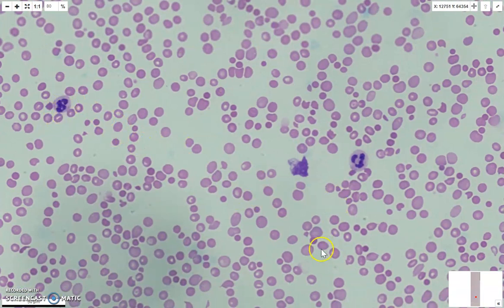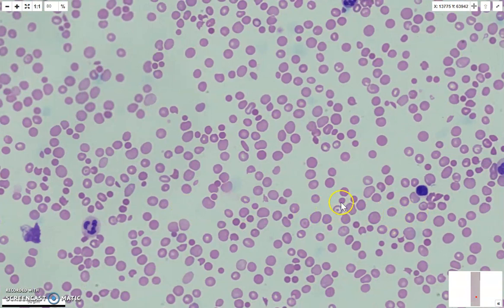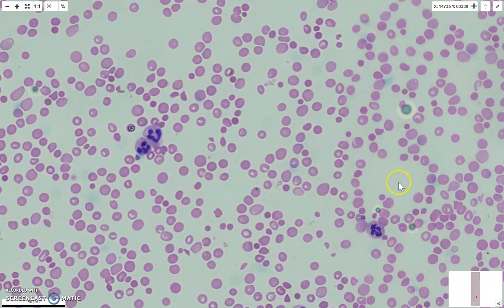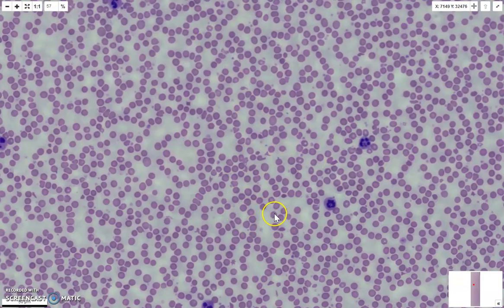There's that's just a smash cell. So the upshot here are schistocytes, polychromasia, some spherocytes, a possible neutrophilia, and definitely a marked thrombocytopenia. If it's under 50, we would call it marked. Now we see a target cell, but that's just a minimal thing, so that obviously is not the most dominant feature in this film. You might also get a possible left shift, so left shift being band forms and occasional myelocyte. So that's that one.